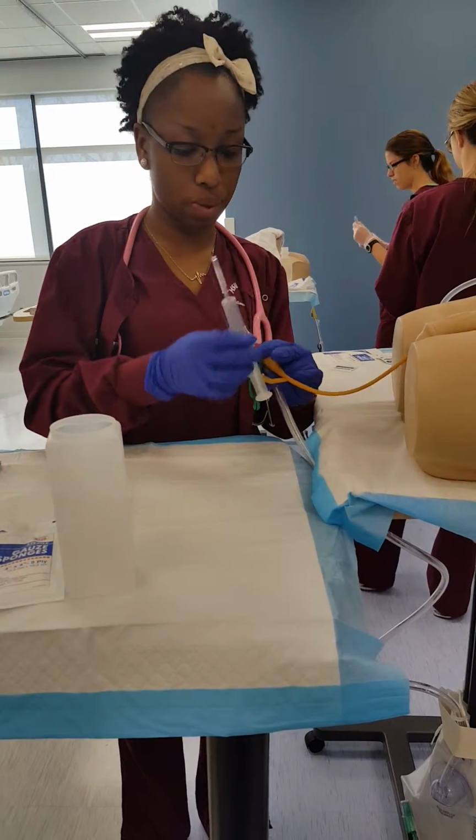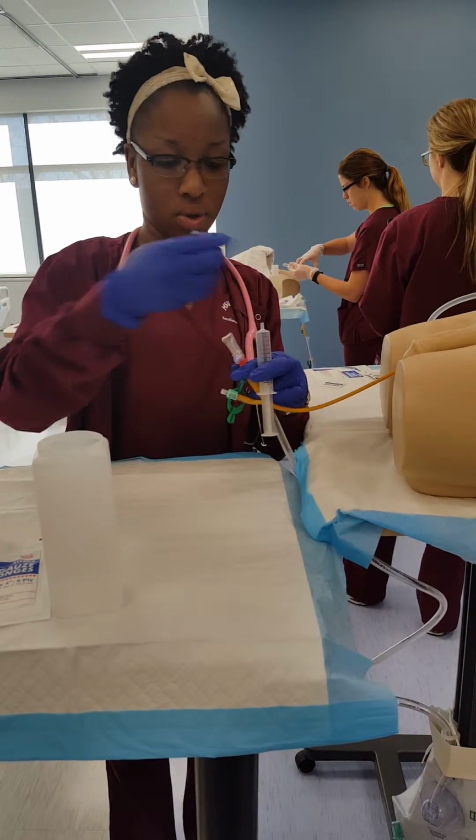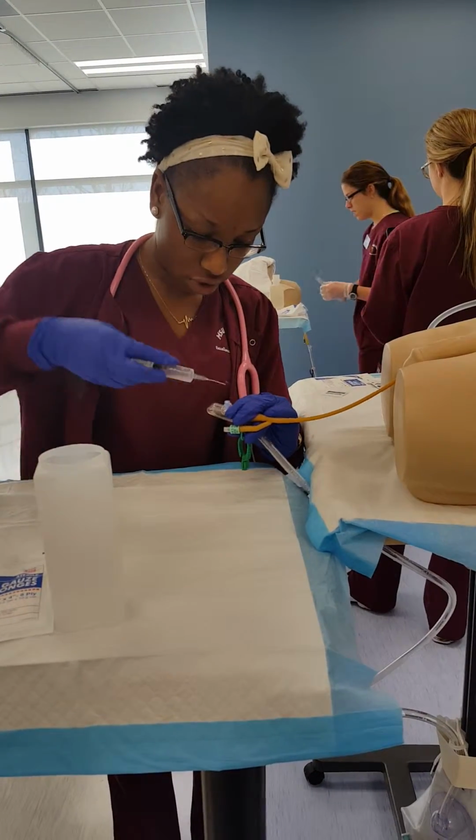Now I'm going to administer my medication. Just put it straight up.